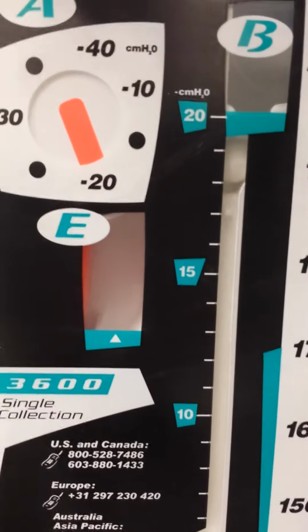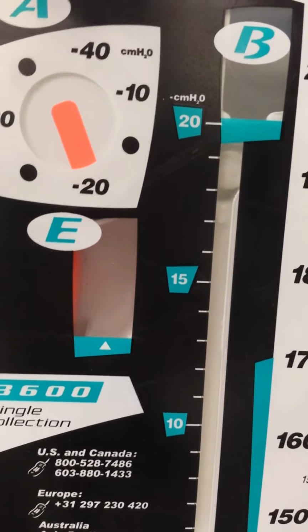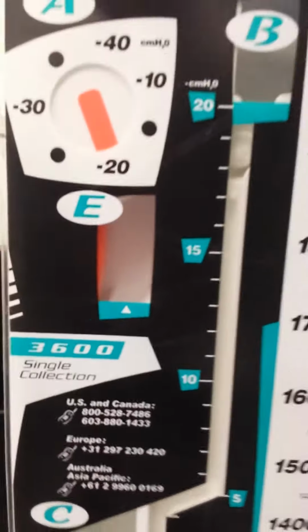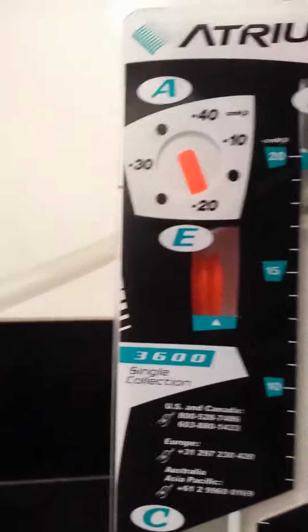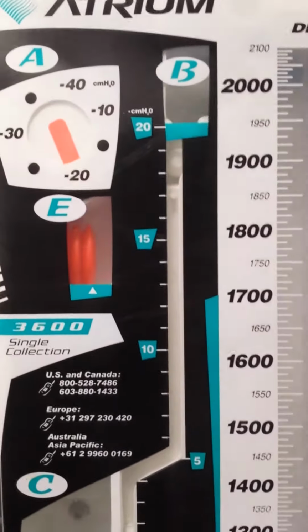Turn it all the way to 0 and then try again. Do you mind just checking it? Okay, and now try. Maybe change to 2. You're at 1. Do we have everything? Oh, this one might be kinked. There it popped out like that because we had a kink. So you want to move it back so that it's right in front of the arrow. Is it there? Yeah, I think so.